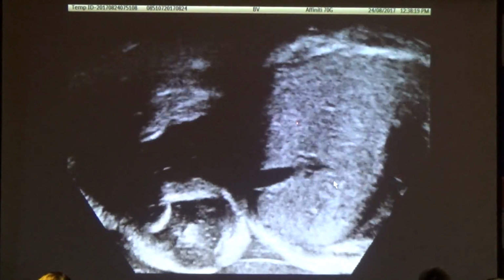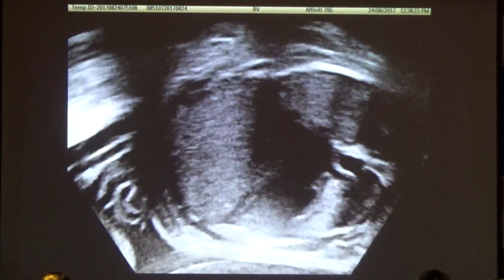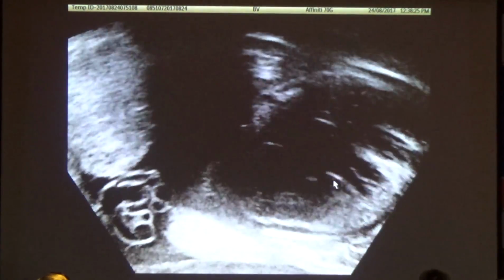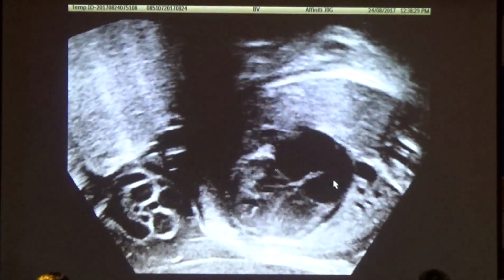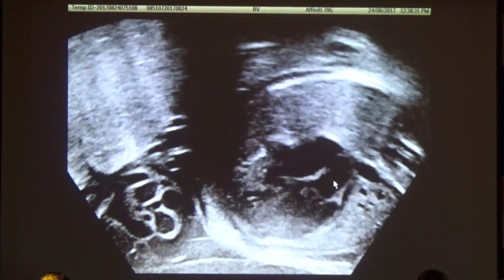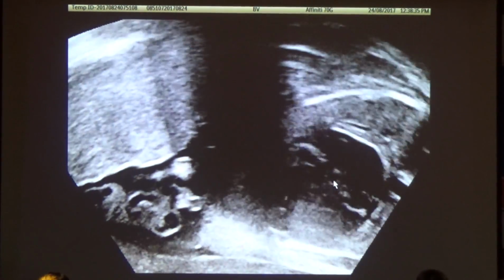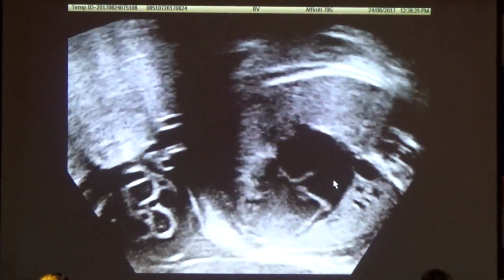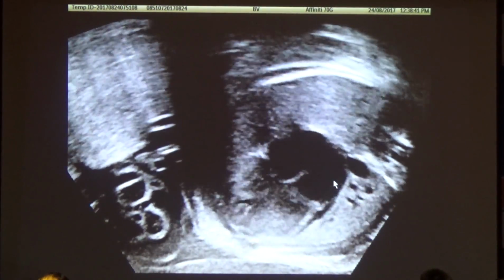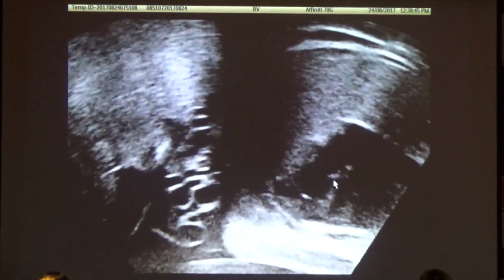All right, let's see what we want here. See, to my mind, okay, so now what we've got to do is see the pulmonary arteries. Funnily enough, for some reason, we're not getting great pictures of the great vessels yet.